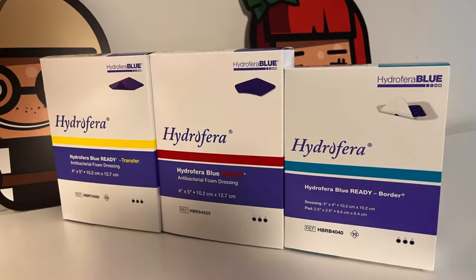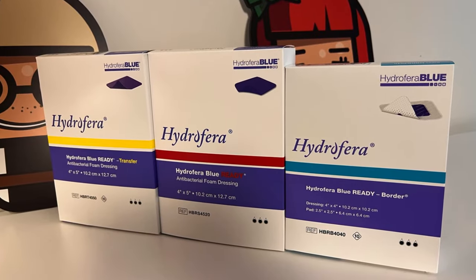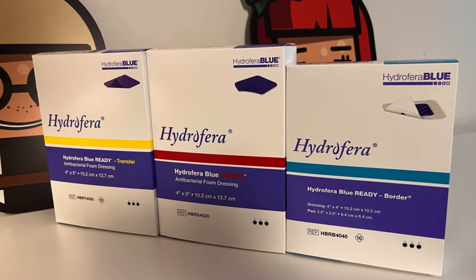A couple of things about these products. There's one called Classic, and the ones we're going to look at today are an improvement and a next generation beyond Classic. The big difference is that Classic is a primary wound dressing that required hydration before you could put it in a wound bed. This does not, and that's where the word 'ready' comes in — straight out of the package, ready to use.